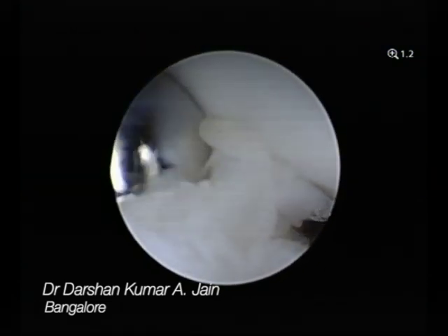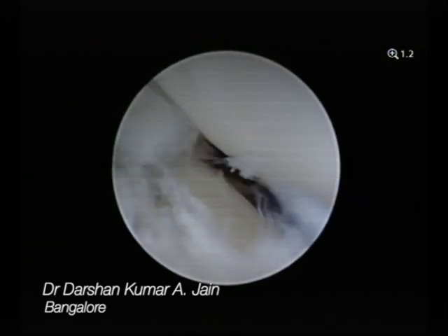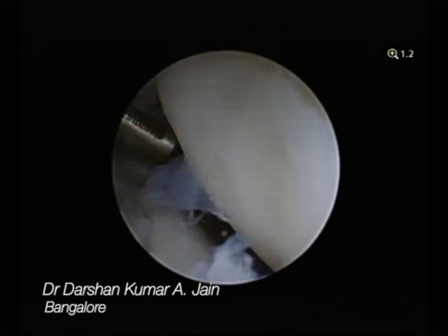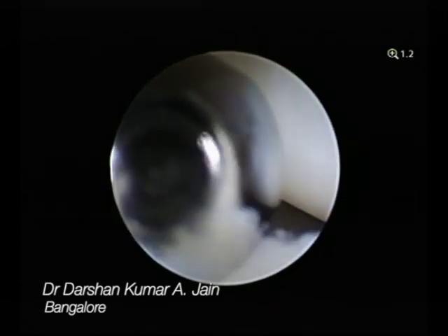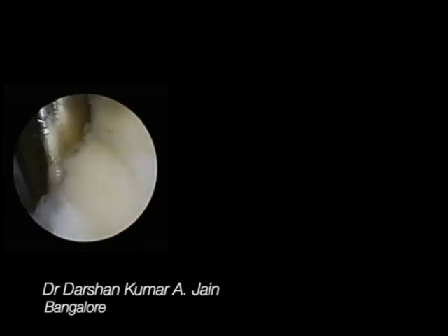Once you clear that, you can see that the distal radio ulnar joint still has a small amount of synovium remaining — you clear that as well. You thoroughly debride the synovium. You can now see the cartilage in the distal radio ulnar joint much better. The TFCC is intact, and that is the superior part where the TFCC is seen. All of this is done through the distal radio ulnar joint portal itself.